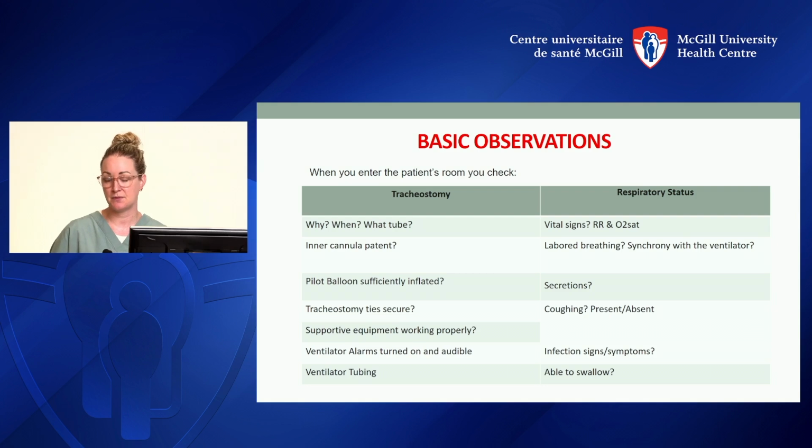Any signs and symptoms of infection, not just respiratory-wise in terms of your secretions. You want to check for signs and symptoms of infection there, but also around your tracheostoma site to make sure that your site is nice and intact. And the ability to swallow.